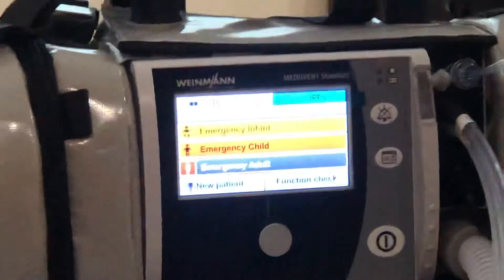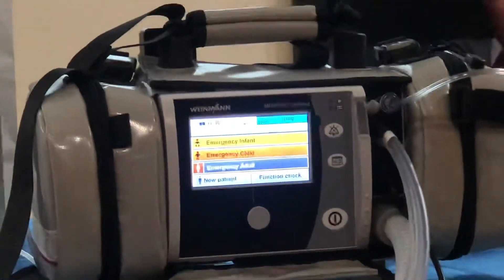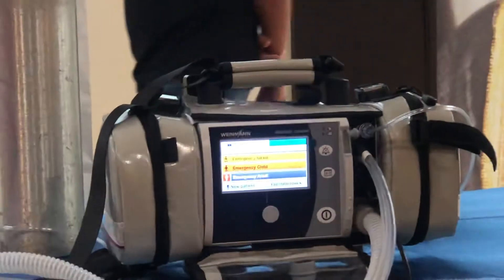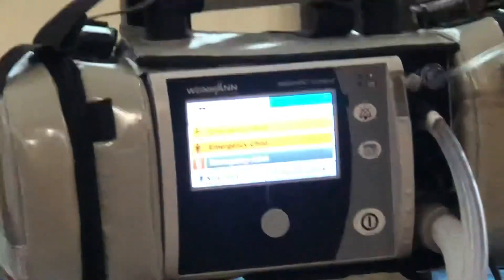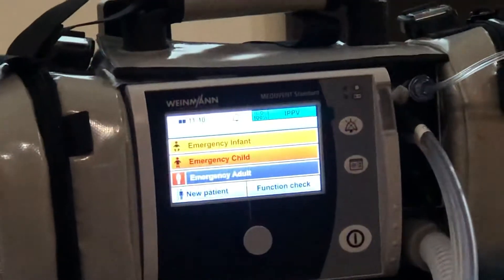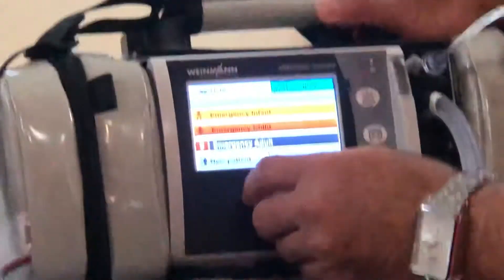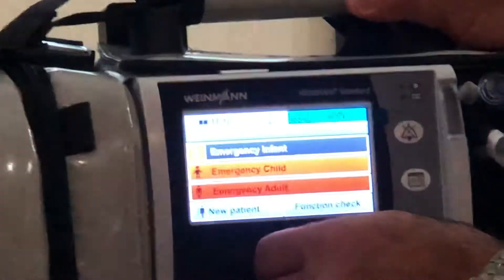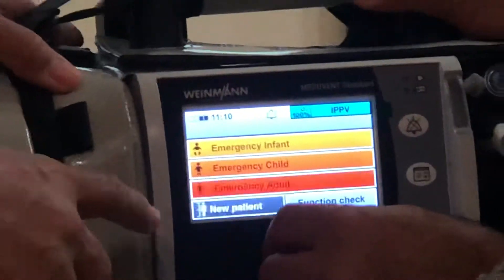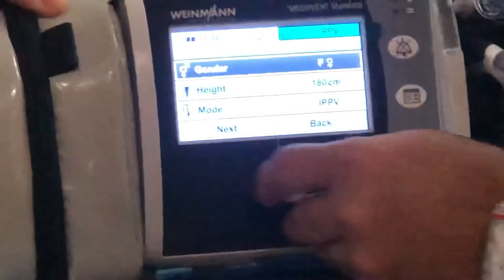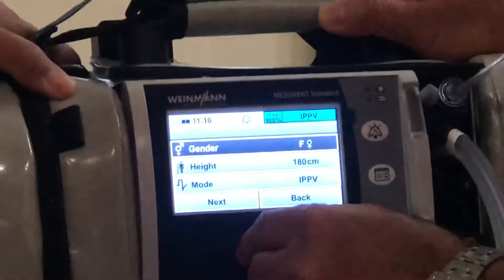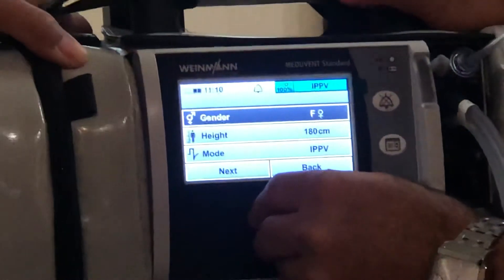Ready for use. Excellent. So now we have a new patient. He's male, 210 centimeters. New patient.